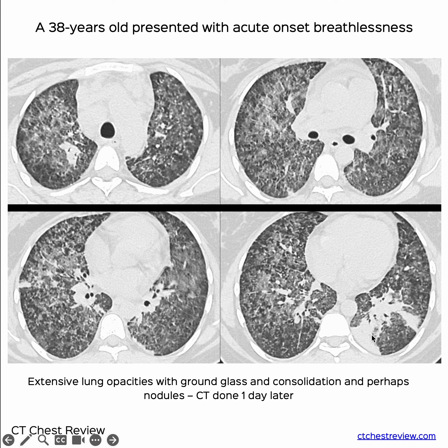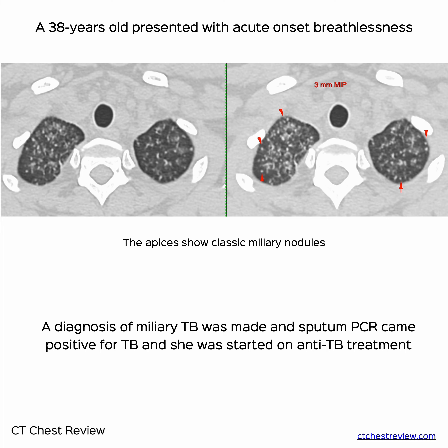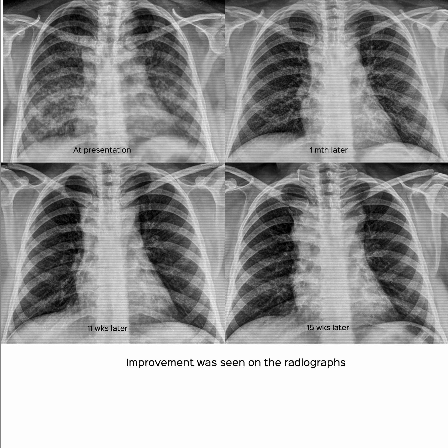There is ground glass, some consolidation, and a hint of possible nodules. In such cases, when you look at the apices — which are the least involved — and use 3mm MIPs, you can actually see these miliary-type nodules, which allow us to make a diagnosis of miliary TB. This was proven when the sputum PCR came back positive.